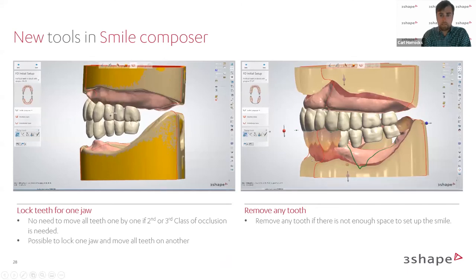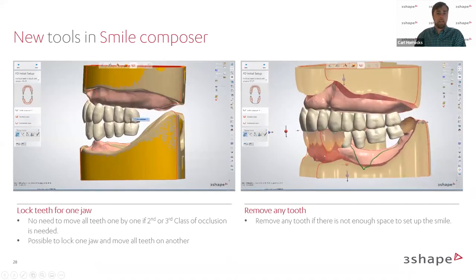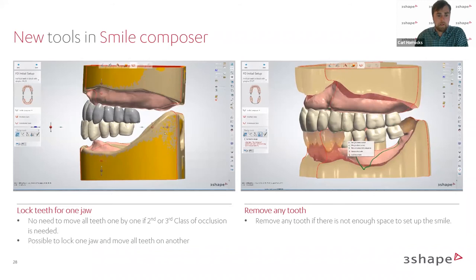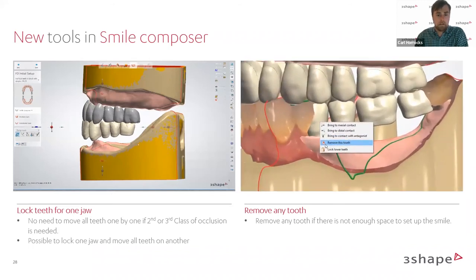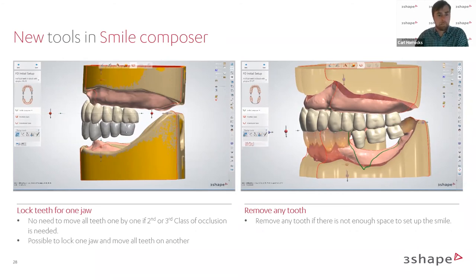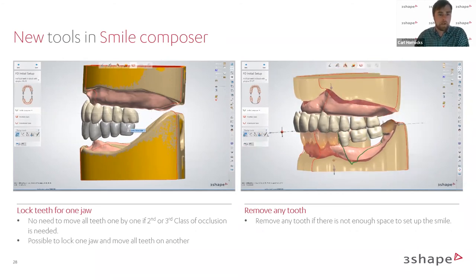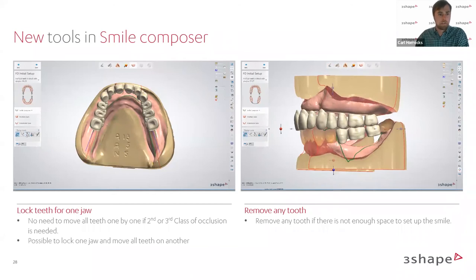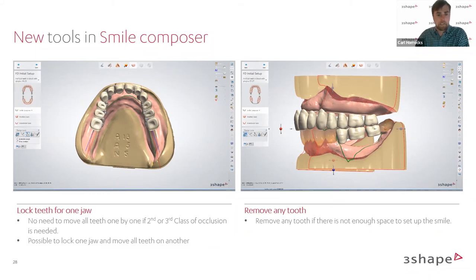The first highlight is the setup. There are different classes of occlusion, and in the past, for a class II or class III bite, you'd have to move each tooth individually one by one in the setup process. Now with the next software version, you can lock a jaw and move that whole arch individually — you can see that on the video. Locking one jaw at a time helps with different types of setup schemes.